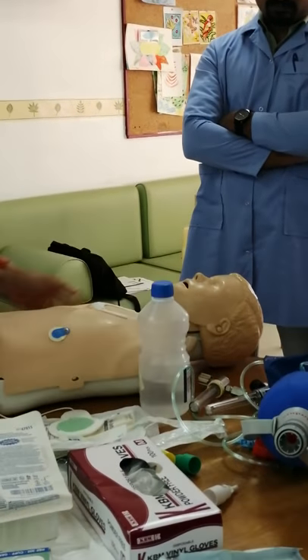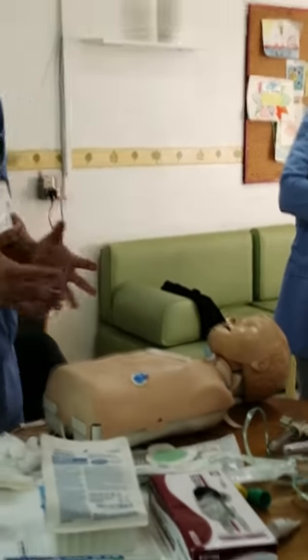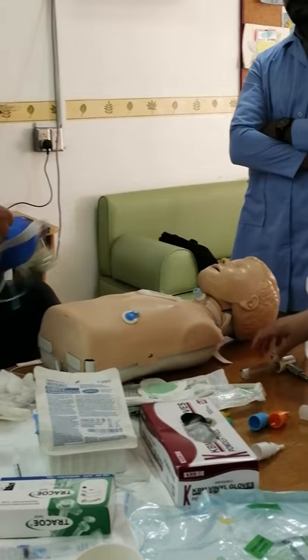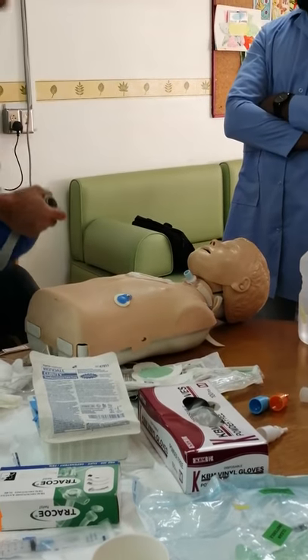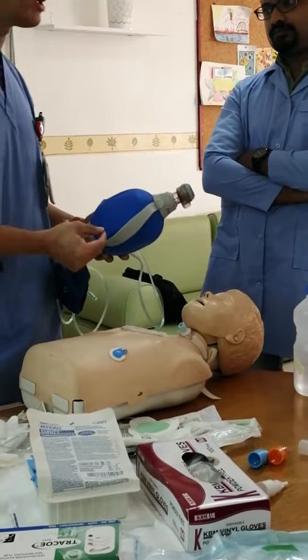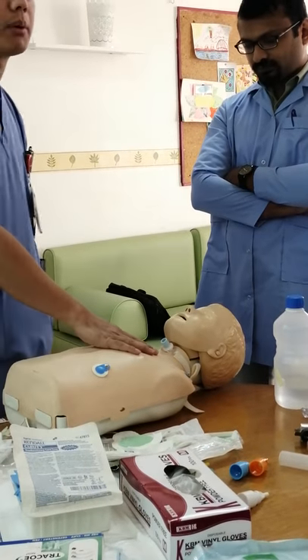Now I'm going to teach you how to do tracheostomy care. First, if you have a patient with a tracheostomy and you receive them in the morning, there should always be an ambu bag at the bedside. Why? Because anytime you need to give positive pressure, or any time you do suctioning or tracheostomy care, you need to hyperventilate the patient. If the patient is not connected to the oxygen source, you use the ambu bag.